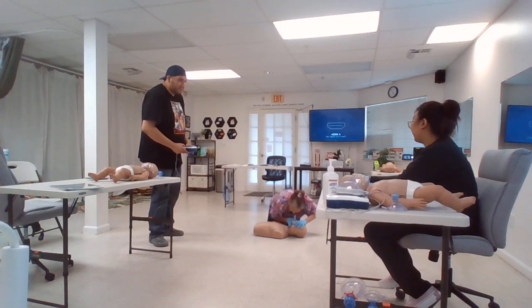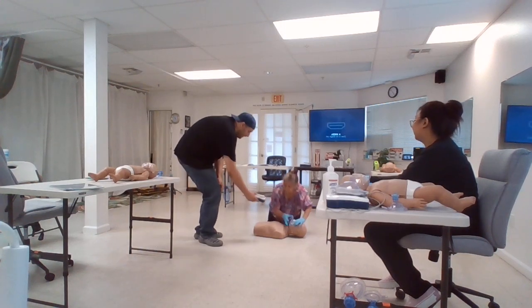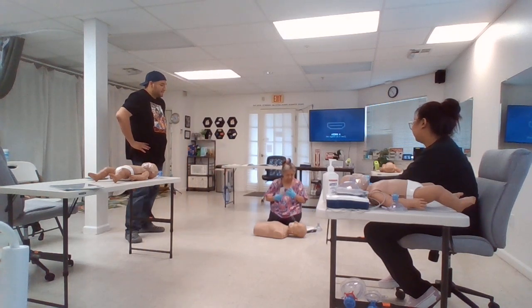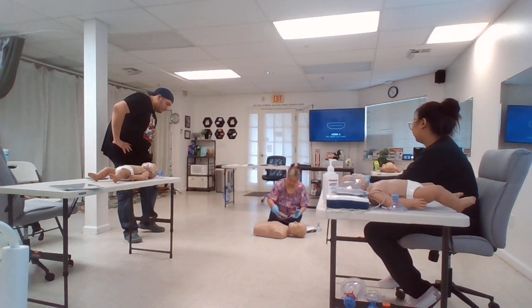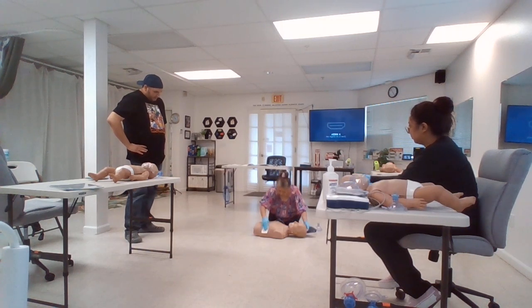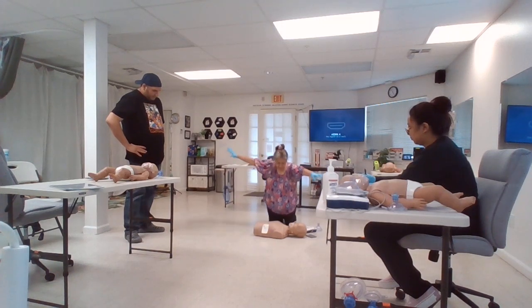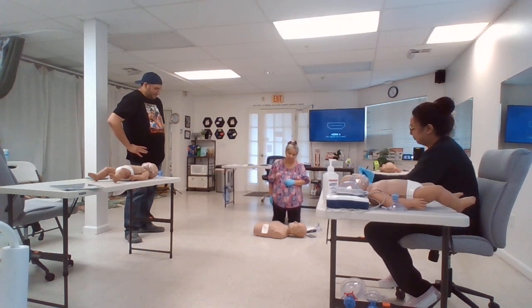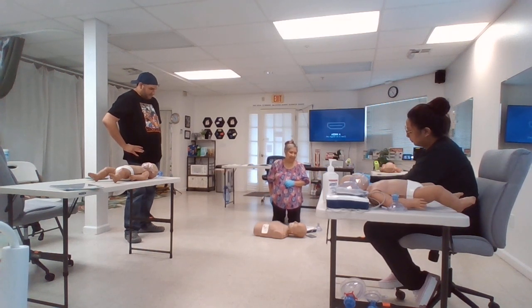Rescuer 2 arrives with an AED. Back with the AED, here you go. Thank you. Adult patient. If the patient is a child, press pads firmly on skin. Do not touch the patient. Clear. Analyzing heart rhythm. Shock advised.